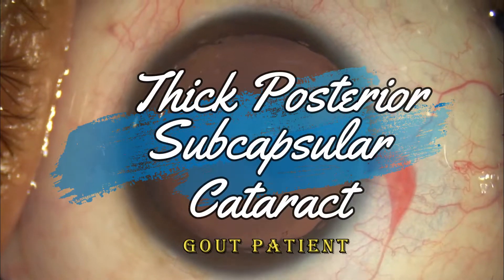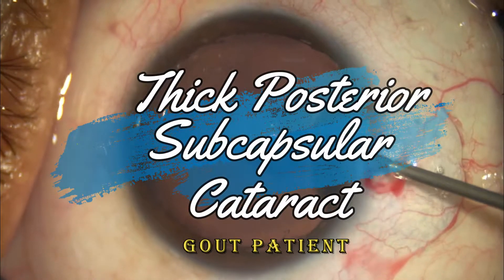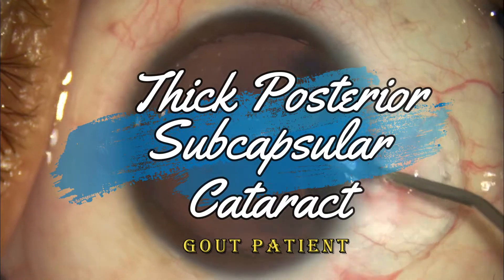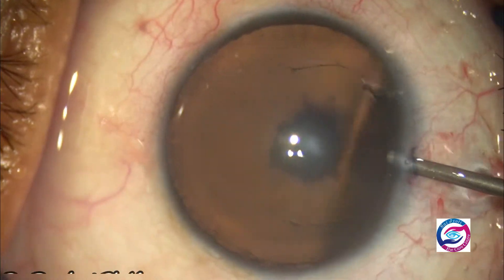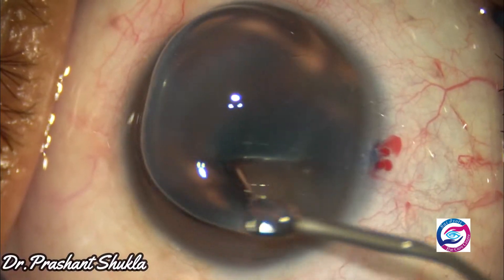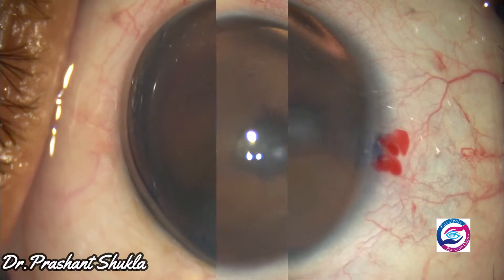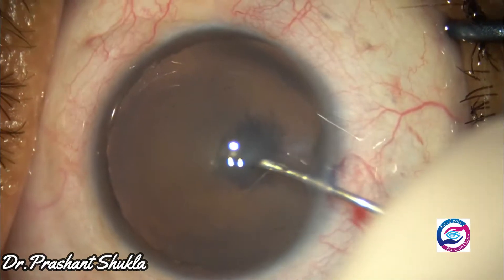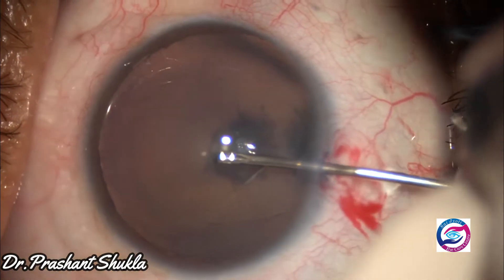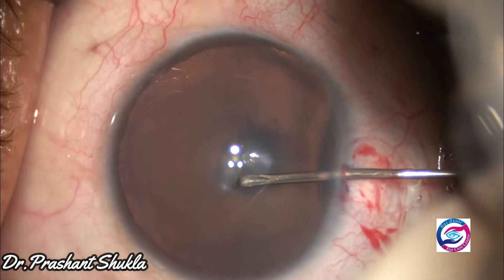Hello and welcome to the channel. Today I am here with an interesting case of a patient suffering from gout. This patient had been on oral steroid medications for a long time, because of which he developed a posterior subcapsular cataract, for which he presented to us. Let's start with surgery.